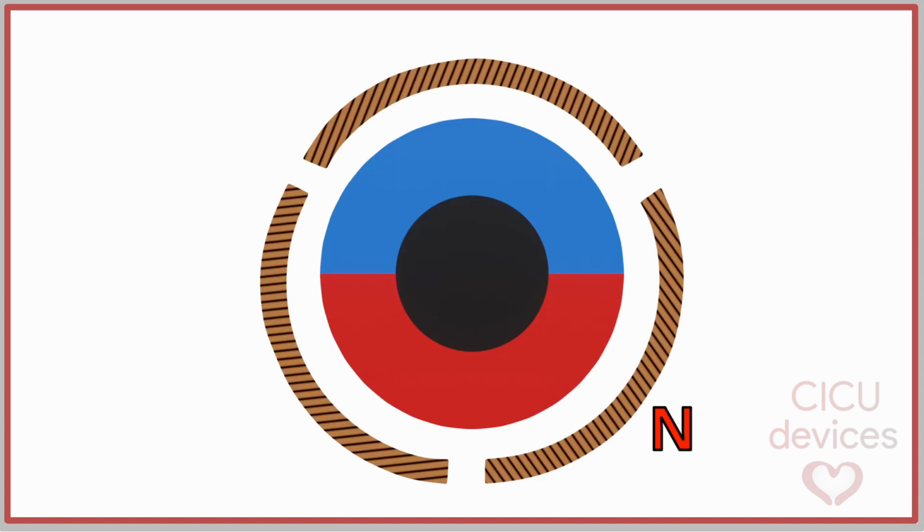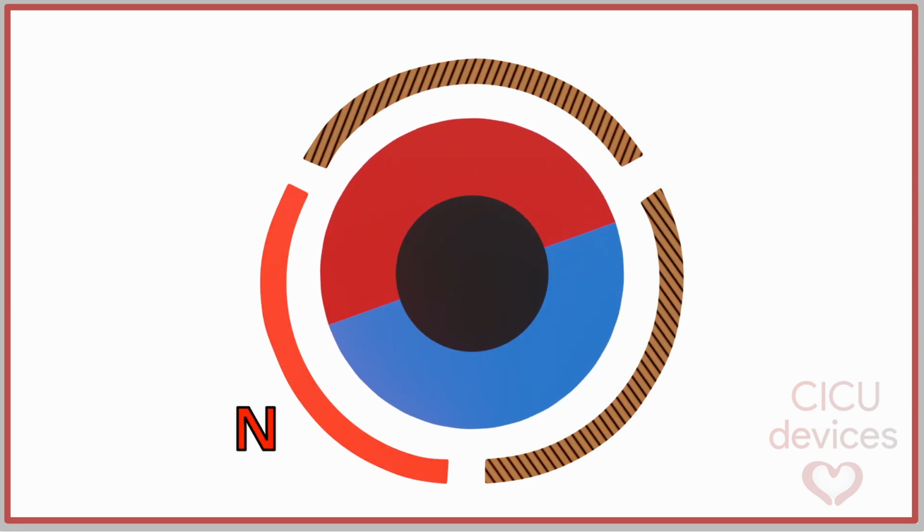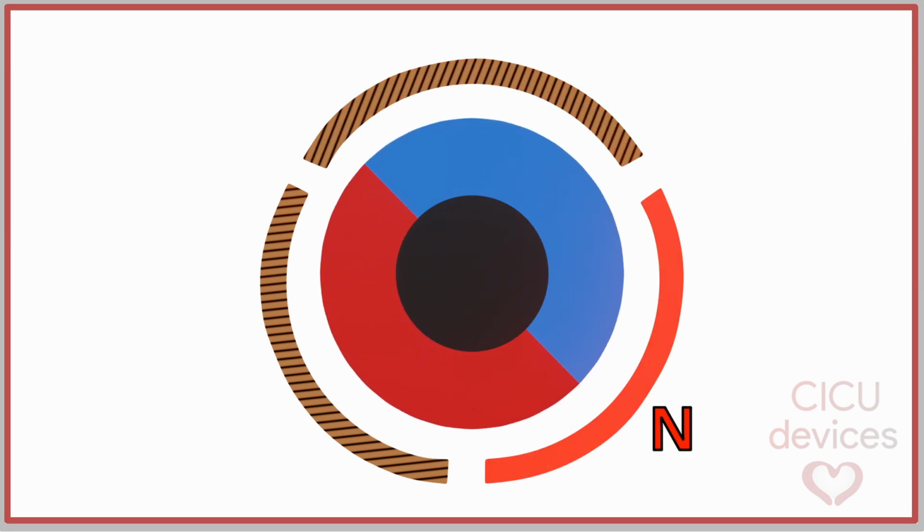In this way, the operation of the motor is as presented in this animation. The stator, powered by an external three-phase electric source, generates magnetic fields that interact with the permanent magnet of the rotor, inducing rotational motion, causing the shaft to rotate, which in turn drives the impeller within the cylindrical pump housing.